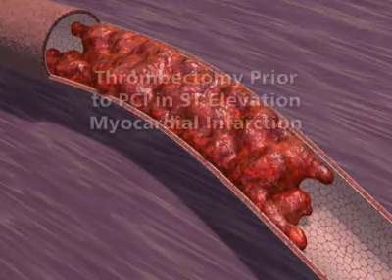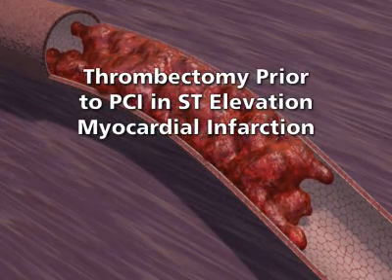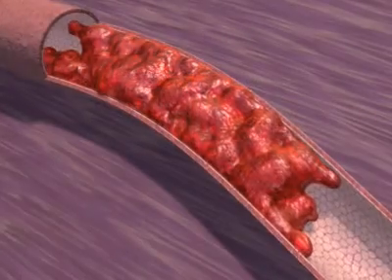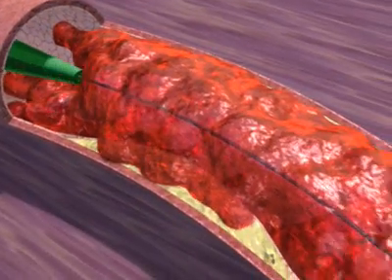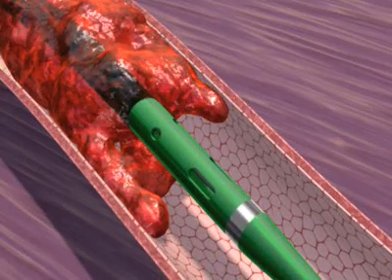Patients with ST segment elevation myocardial infarction may benefit from thrombectomy at the site of occlusion before balloon dilatation and stent implantation, thereby preventing embolization and distal myocardial injury. The same patient could be treated with angiojet thrombectomy prior to stenting.